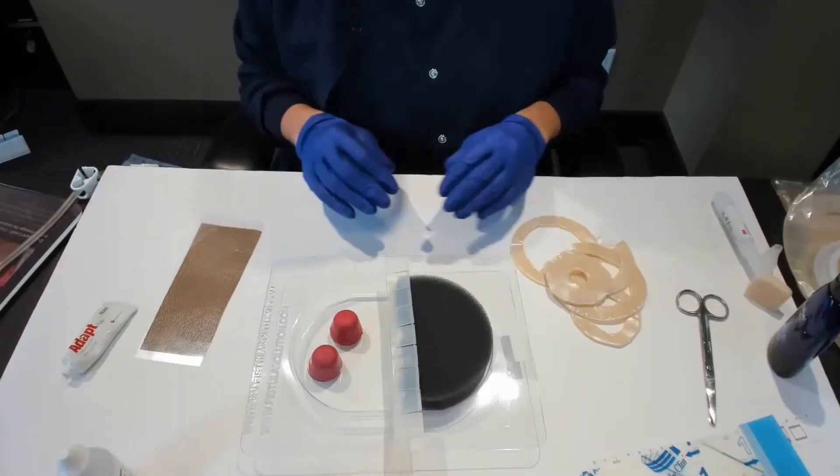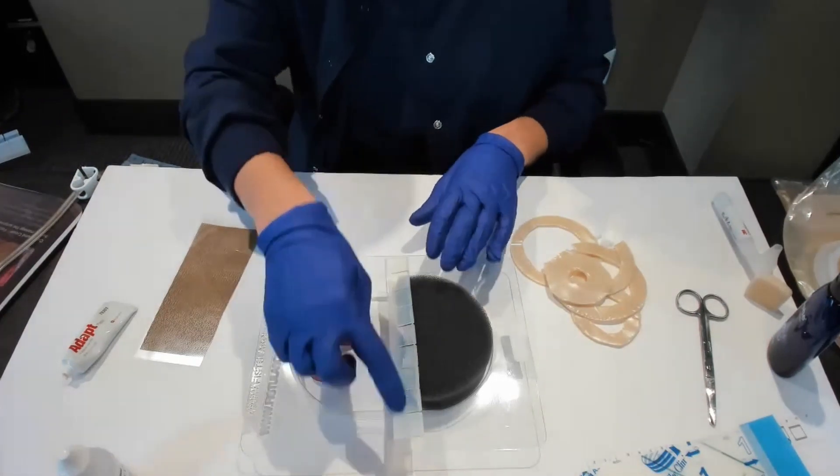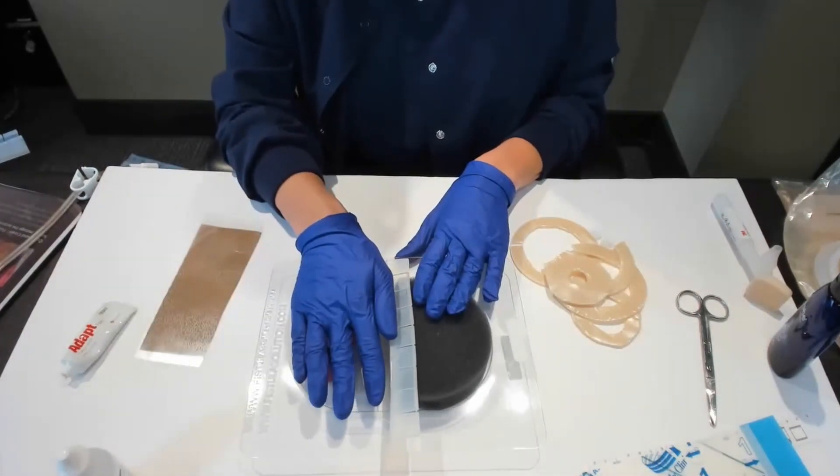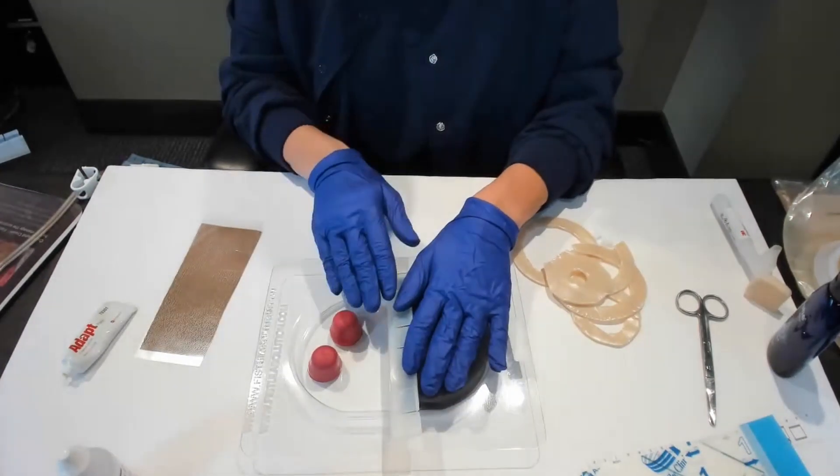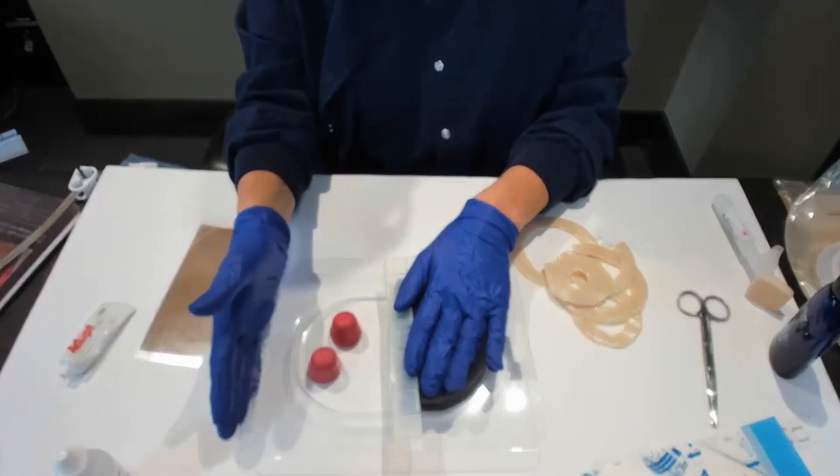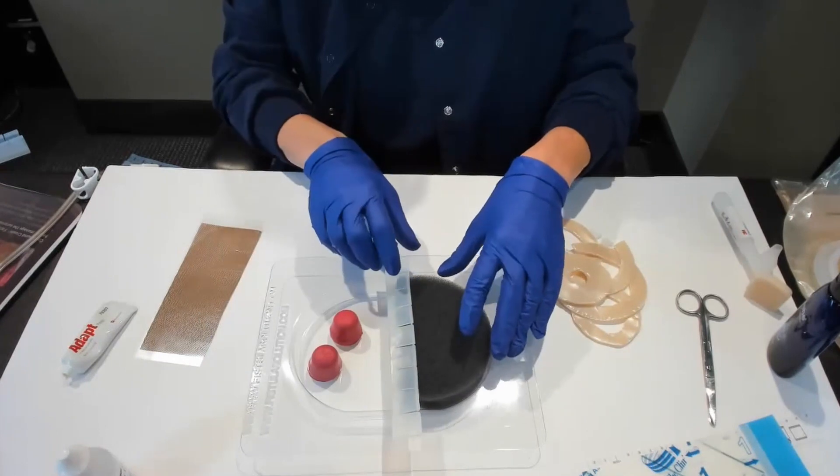We're going to go through utilizing the isolator strip side to side. So you have a group of fistulas over here and you have a wound over here. You just want to isolate the fistulas in their own section.